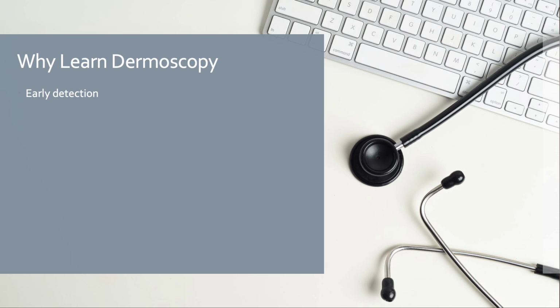So in a nutshell, what's the importance of learning dermoscopy? It helps in early detection of skin cancers. It acts as a screening tool, especially keeping in view the increasing number of skin cancers all over the world. It's especially important in special locations like face, genital area, mucosal surfaces, or nails, where this can eliminate the need for doing unnecessary biopsy.